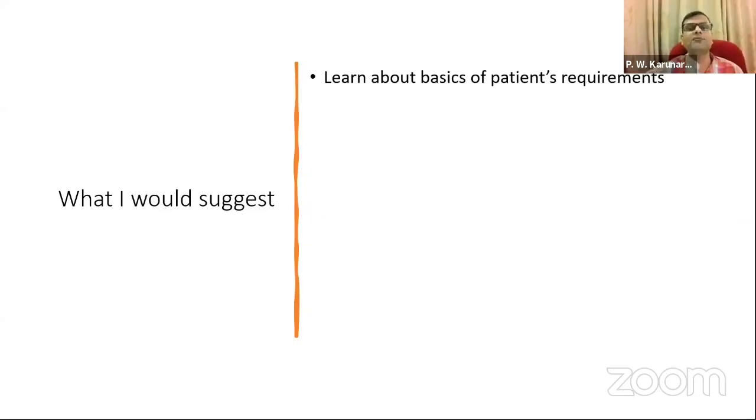Are they breathing faster? What kind of minute ventilation? Ventilation means the volume, I mean, the amount of gases. Like we call one breath, the volume of a breath, tidal volume. And if you multiply that by the respiratory rate, you will get the amount of gases going in or out per minute. That is what we call ventilation, minute ventilation.